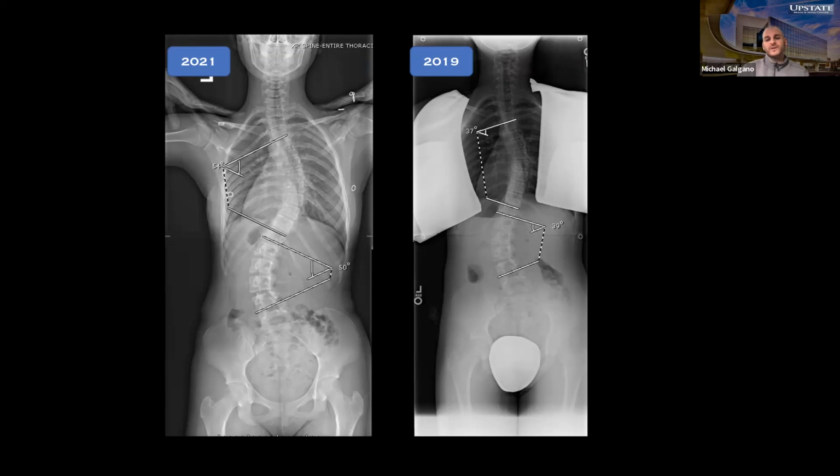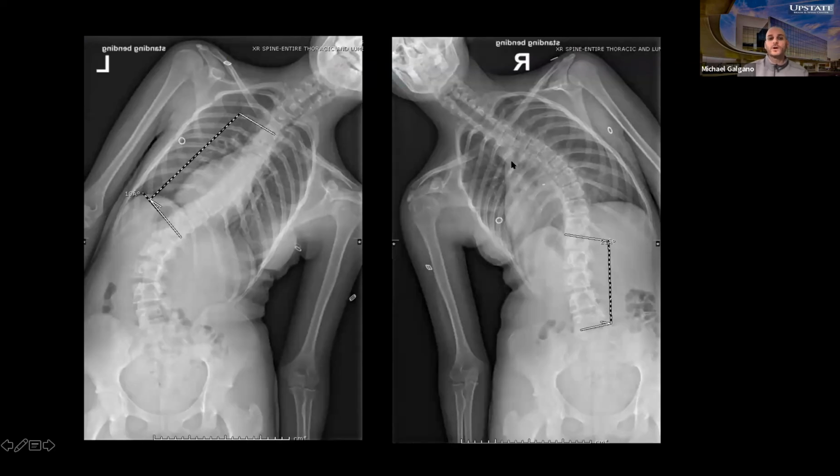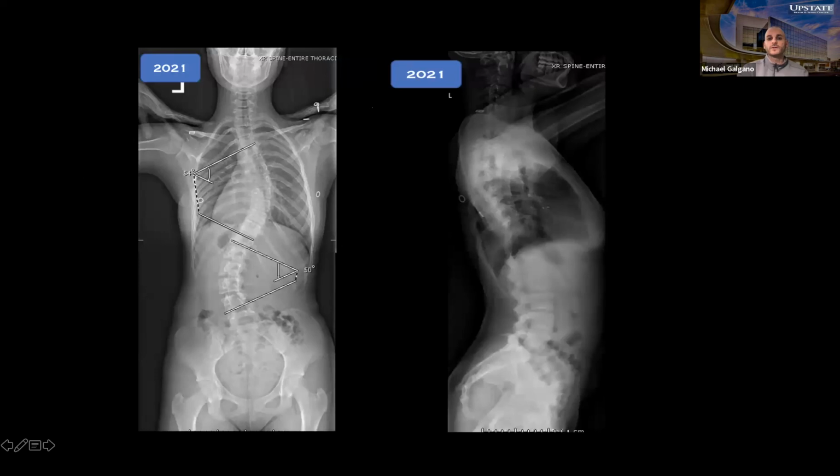And she's having a lot of kind of vague back discomfort, cosmetic issues. Just not very happy with the overall appearance here. And obviously, she's only 14; she's still growing. We can appreciate on these upright sagittal x-rays that she really has no thoracic kyphosis as well. And these are her bending films. And we can see both of these curves are relatively flexible. They both bend out to less than 25 degrees here.